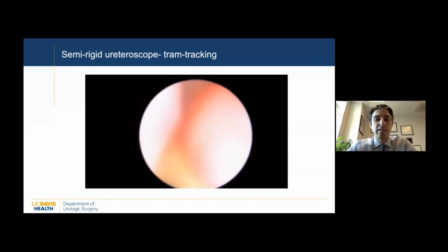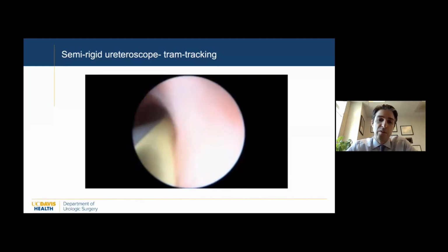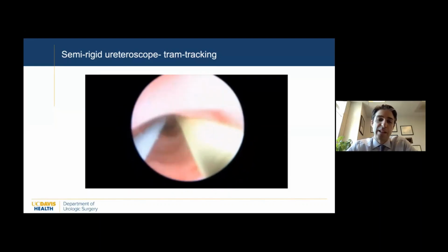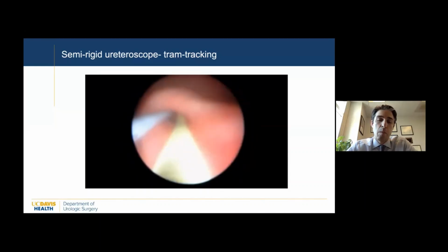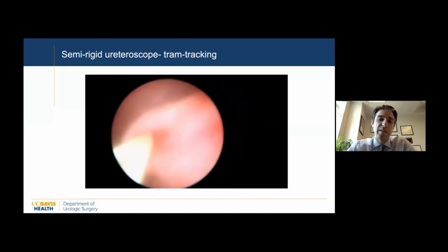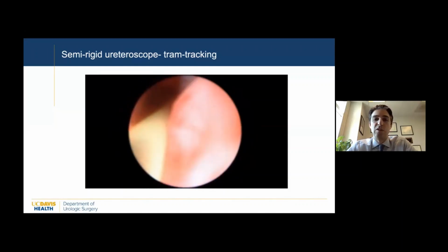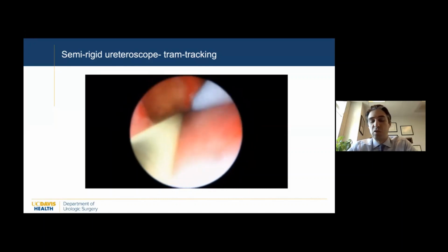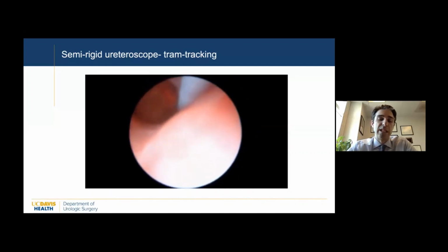that second wire. And I always say, if you're not in a good position with semi-rigid ureteroscopy, back that scope up. So we back that scope up and realign, and again, split that difference between those two wires, maybe with a little twisting action with the scope, and you'll get in. Using this technique, which a lot of people use, really helps to prevent the need for balloon dilation of that intramural ureter.